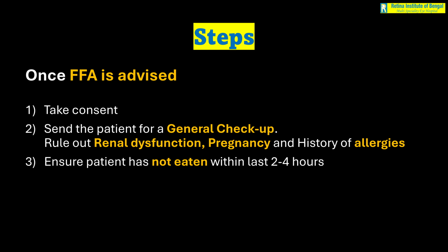one common side effect or complaint of patients, especially young patients who are undergoing fluorescein angiography, is that after the injection of the dye, they often complain of nausea or a sensation of vomiting. Now, if a patient has eaten, it's very likely that he or she may actually vomit. Therefore, it is safer to keep the patient on a relatively empty stomach before doing the test.